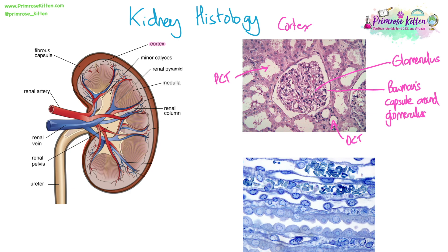In the cross-section you can see tubule structures: we've got the proximal convoluted tubule and the distal convoluted tubule. The proximal convoluted tubule is normally a bit wider in diameter in the lumen than the DCT, which is how we can tell them apart. Also, the brush border may be visible inside the PCT, which you don't have inside the DCT.